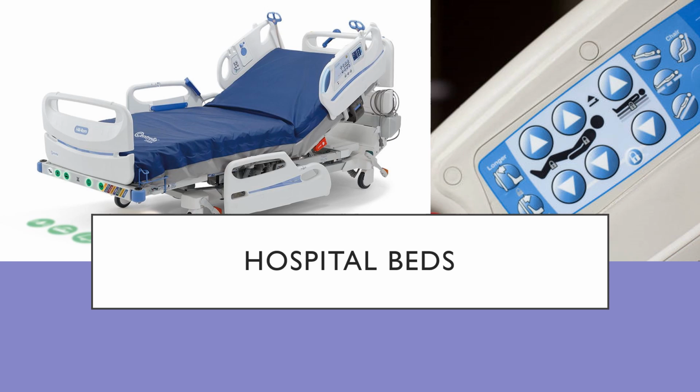And the cutouts within the railings allow for patients to assist in rolling side to side and adjusting themselves in bed. The hospital bed is a simple tool in a healthcare worker's arsenal that can make a huge difference in reducing injuries during patient handling.